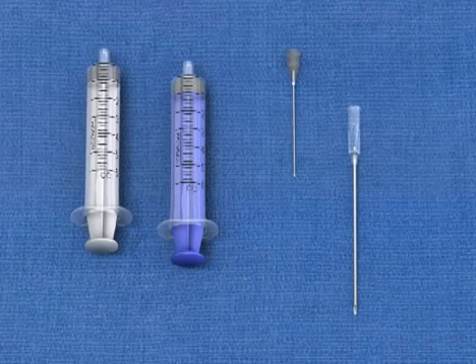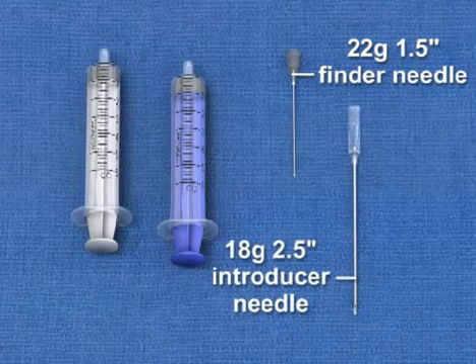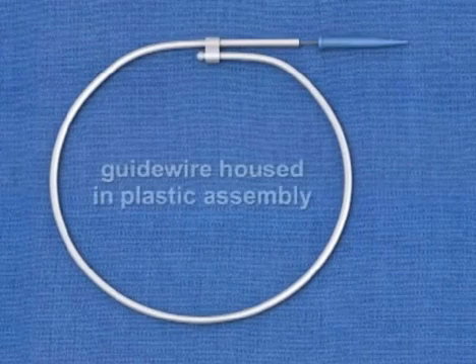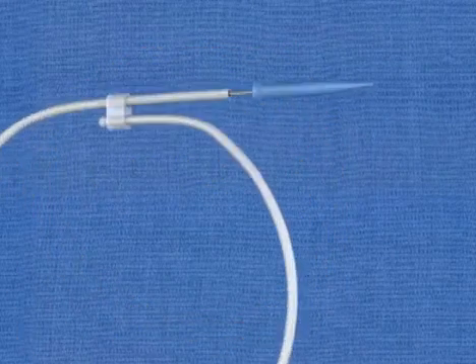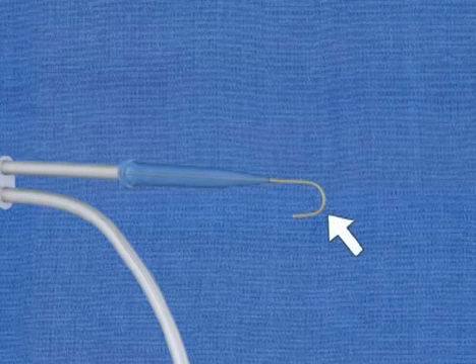A variety of needles. These include a 22 gauge 1½ inch needle that is used as a finder needle or for administration of a local anesthetic. And an 18 gauge 2½ inch introducer needle that is used to cannulate the vein. A guide wire housed in a plastic assembly, which is required for the Seldinger technique. Note that the guide wire has a spring-loaded mechanism that creates a 180-degree bend at the distal tip of the wire.